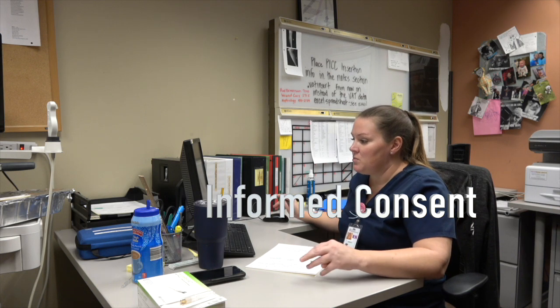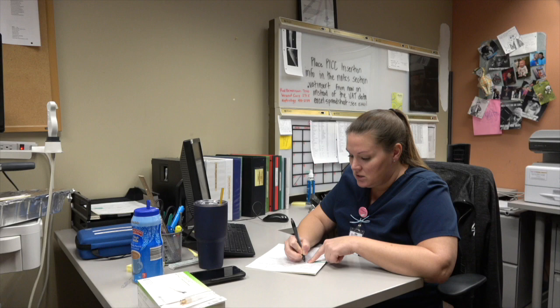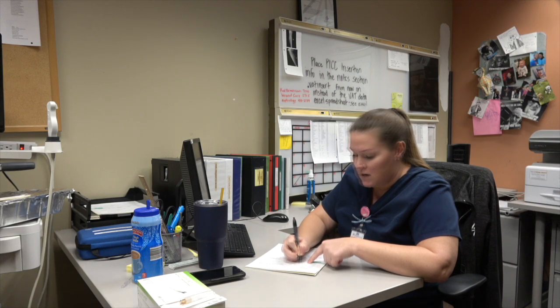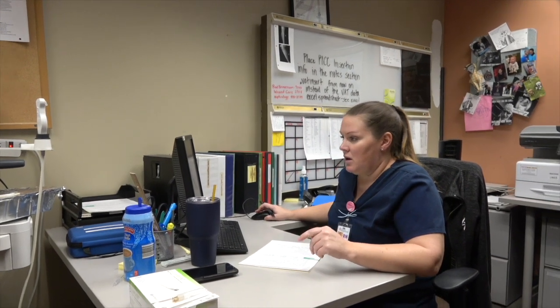I'm going to check the patient's MAR, check what kind of medications they're on. This patient is receiving some antibiotics and has also received some blood products. She's going to be on antibiotics. Also want to make sure whether the patient is on a blood thinner or not. If they're on a blood thinner, we just want to document the type of blood thinner, how long they've been on it, and just make sure if they need any kind of coagulation studies that they've been done. Is there an INR that you drop off?